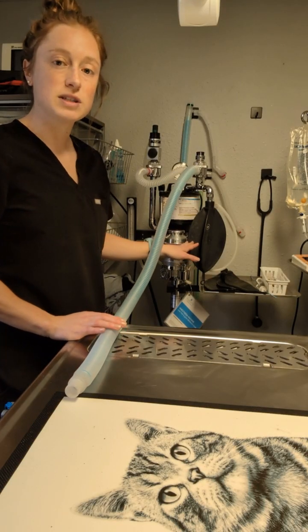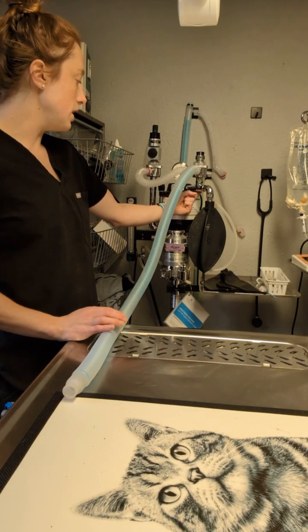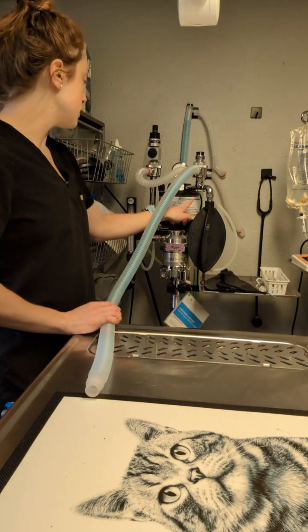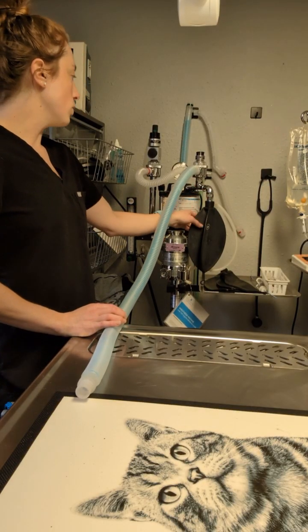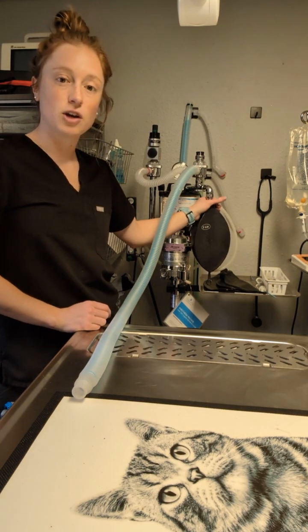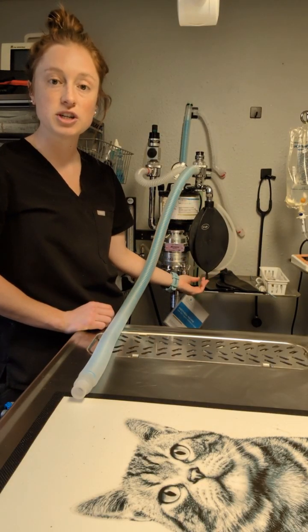Then the oxygen, once mixed with the isoflurane, will go up into our inlet valve. So this will be partially the anesthetic gas, and we'll also be mixing with the fresh gas supply from some tubing behind. So we have our inlet port here. It will go to the reservoir bag. The reservoir bag is a flexible storage for any of the gases that we want to deliver to the patient.